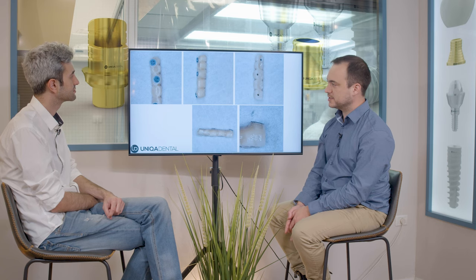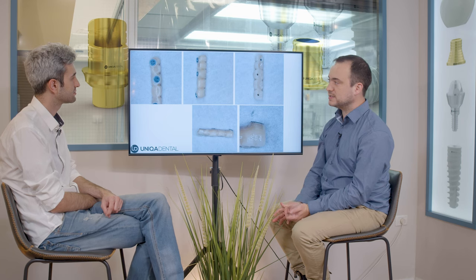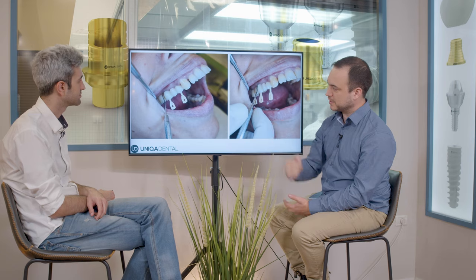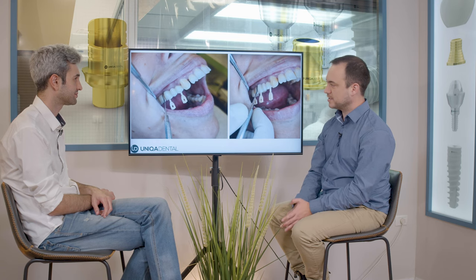This is the final restoration. You can see it's zirconia with glaze. The gingival part is without glaze at all because that's the area where you don't want plaque accumulation — this part will be from zirconia and just polished as much as possible. You can see the color of the glaze; the crown looks very nice and the color is amazing. We did it in our clinic and closed the screw channels. Great bridge — three implants and five crowns.